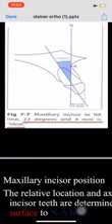The long axis makes an angle with the NA line of about 22 degrees, and there is a distance between the NA line and the incisal edge of about 4 millimeters. So he said the long axis of the maxillary incisor to the NA line makes an angle of about 22 degrees, and 4 millimeters is ideal, if the incisal edge is away from NA by about 4 millimeters.